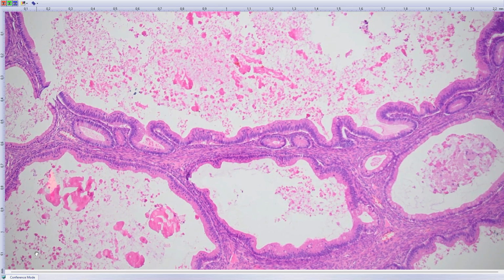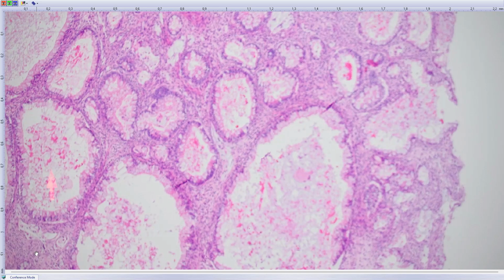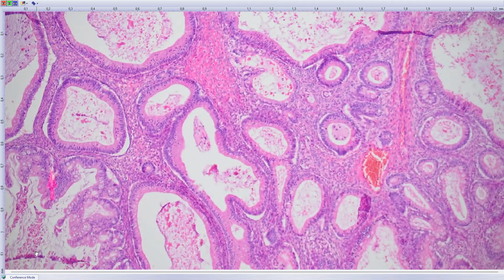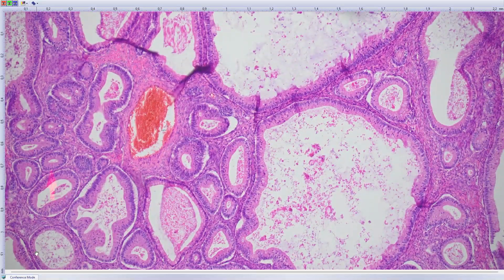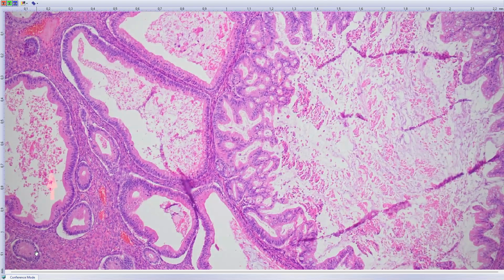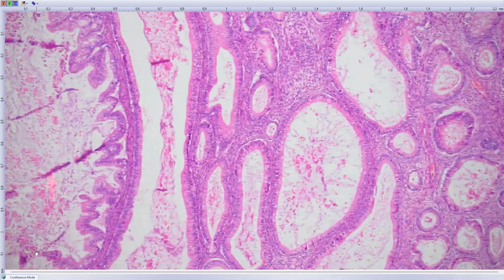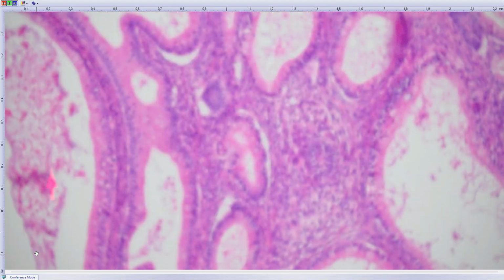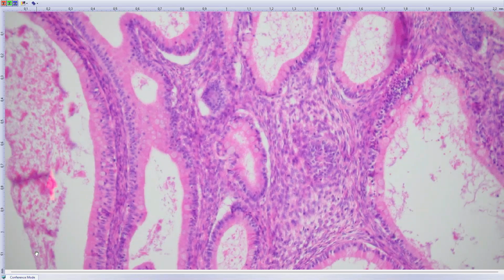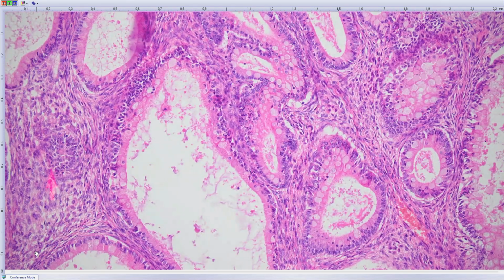This is borderline or teratoma. No, I think that it is... I would call it generally a mucinous borderline tumor, but in some places, even on an H&E slide maybe, there were areas of microinvasion.